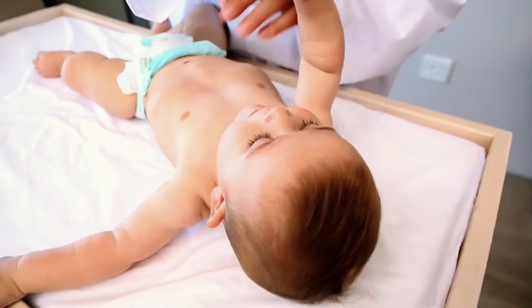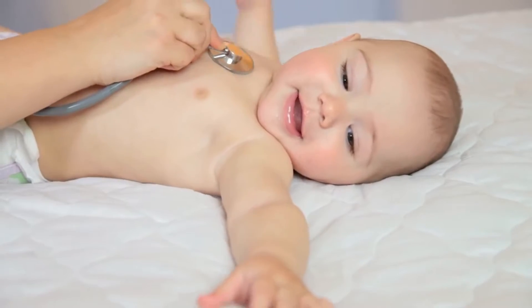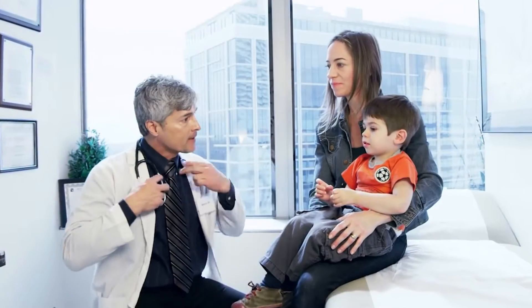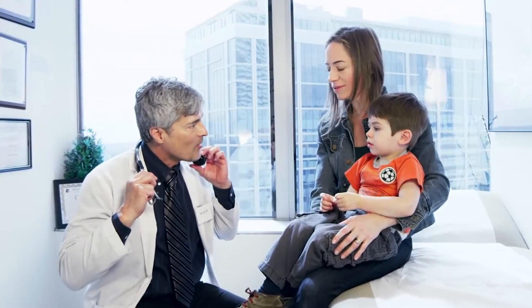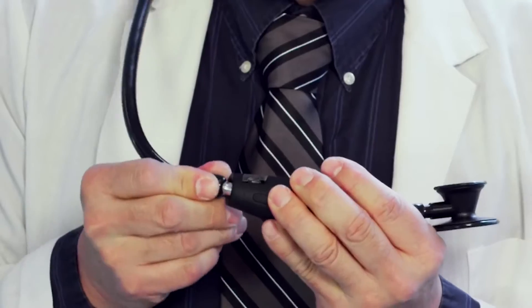For centuries, clinicians have touched lives with the help of a trusted companion, the stethoscope. Today, that companion is made stronger. Meet Core, the next evolution in stethoscope technology.